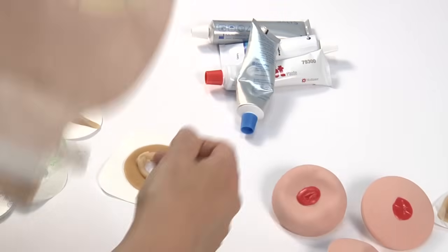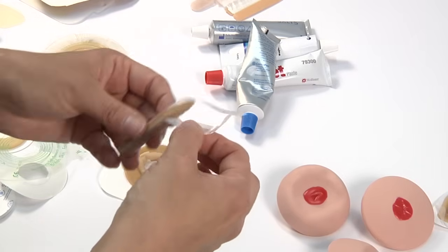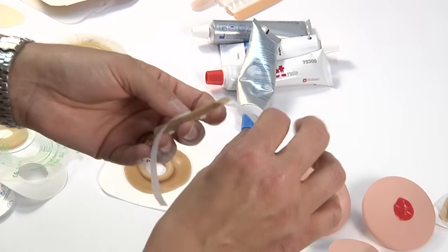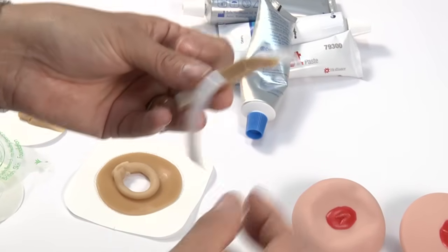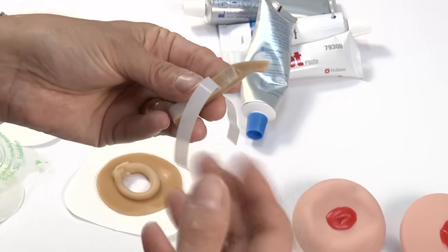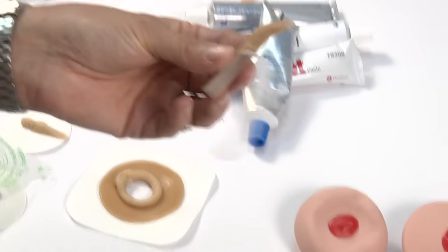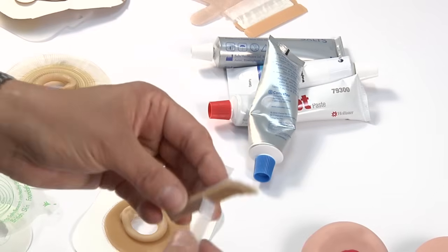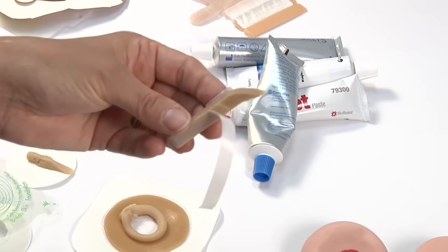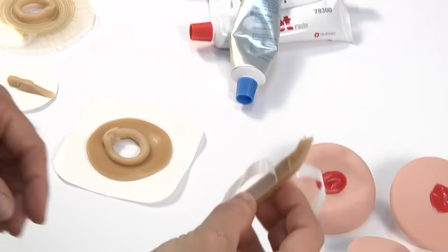So there's a lot of flexibility. As I said, with the Strippaste, it doesn't have any alcohol. It has a moderate to good amount of erosion resistance. Again, that is really somewhat clinician biased and based on experience. And it will absorb some moisture and actually puff up around the stoma when in contact with the moisture from the effluent.